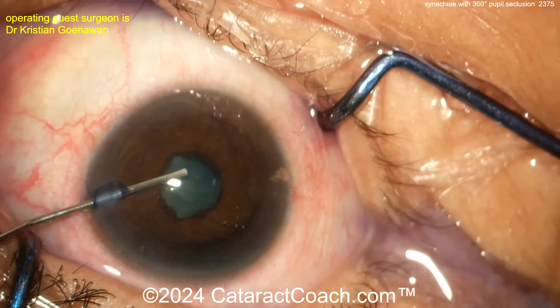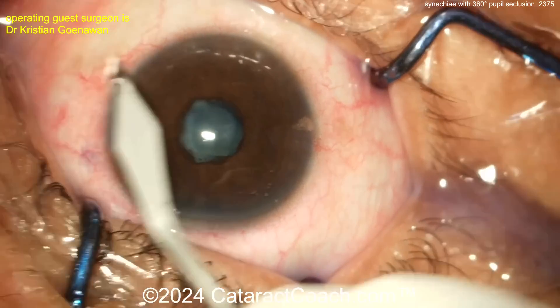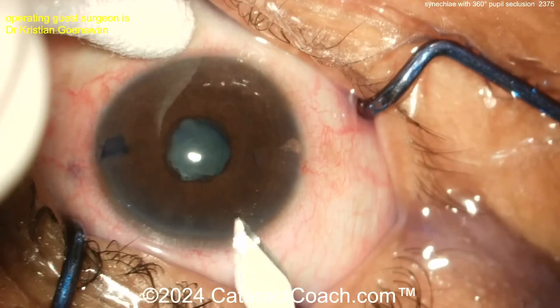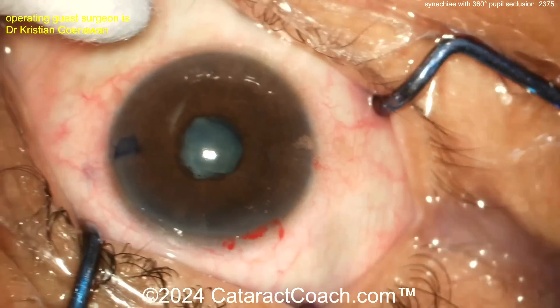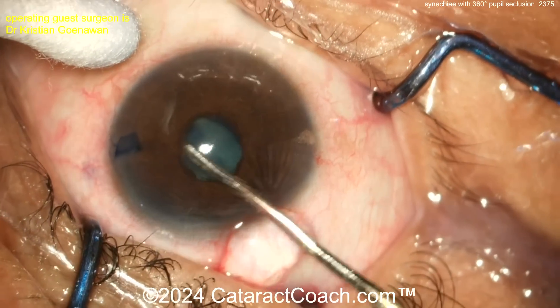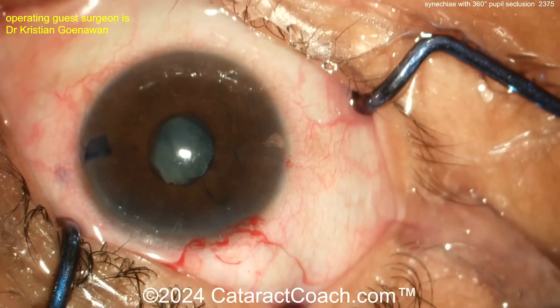More viscoelastic goes inside the eye, and once you have that in place you'll need some sort of pupil expansion. Do you want a pupil expansion ring, iris hooks, or a pupil stretch? Let's watch together. The surgeon is making an incision with a keratome, more viscoelastic is going in, and they begin breaking the synechiae. Sometimes there's a pupillary membrane that needs to be peeled off first.